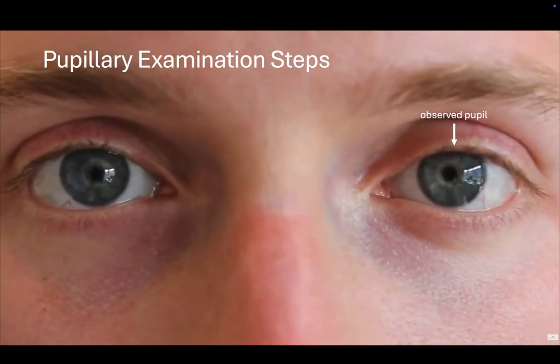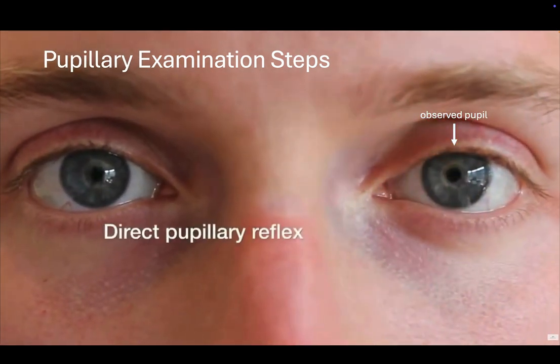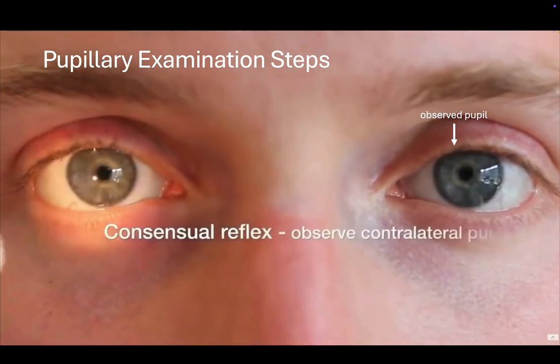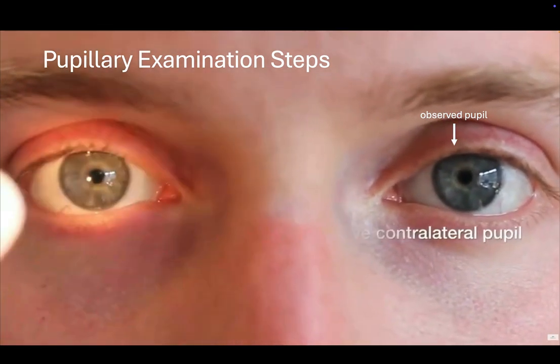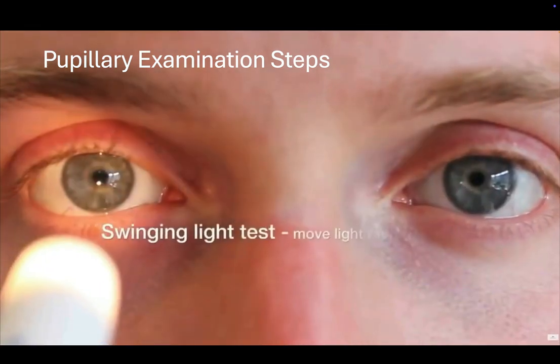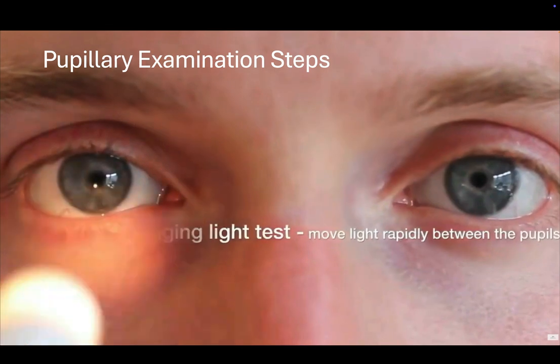Then observe the direct response, which is constriction of the illuminated pupil. Then observe the consensual response, which is constriction of the opposite pupil. The swinging flashlight test is then performed looking for a relative afferent pupillary defect.